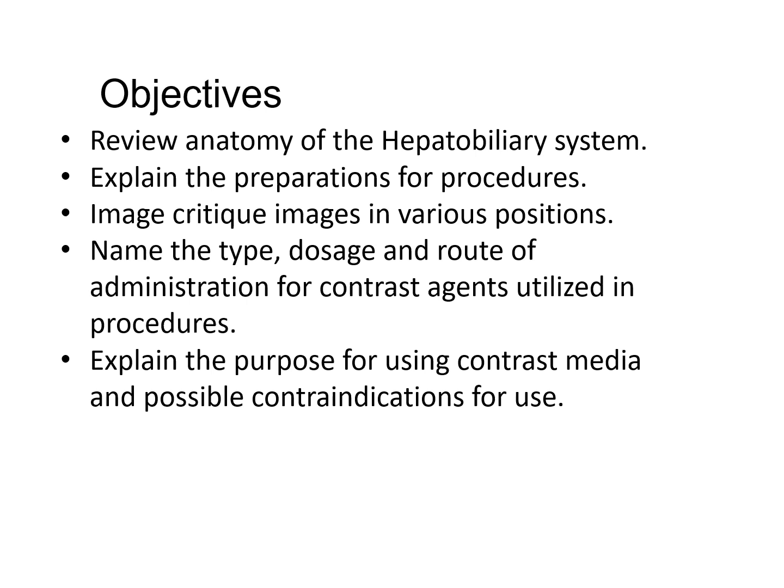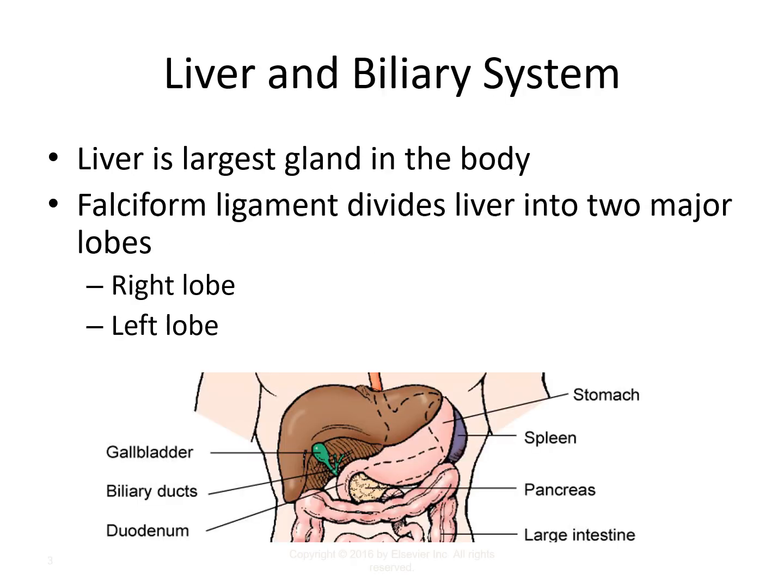So it should be reabsorbed readily by the body if it gets to an unintended place, and taken up by the lymphatic system without much in the way of infection or septic shock or any of those types of risks. So, all right, moving on.